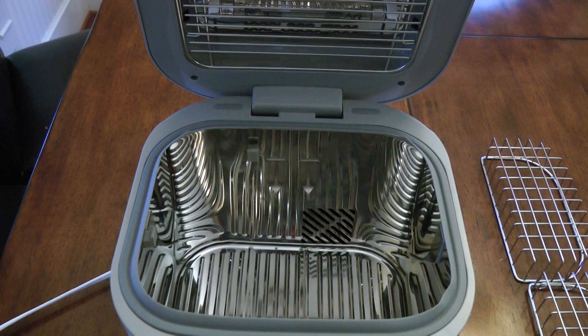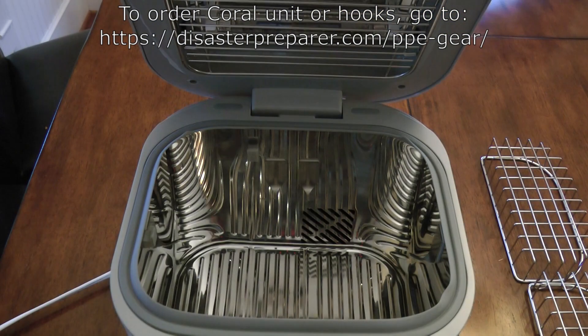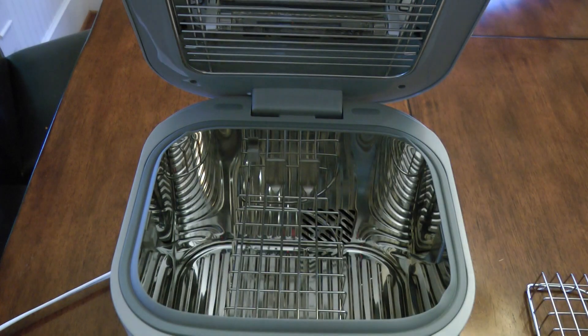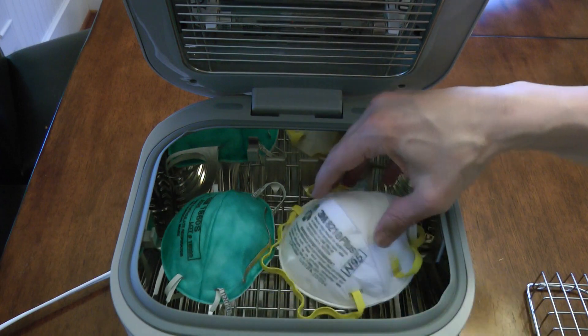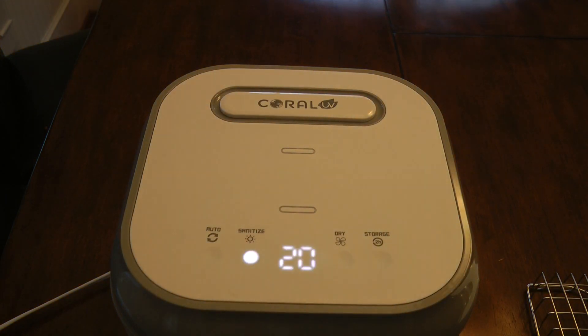This video is going to show how to install the hooks in the UV Coral Sanitizer, which I recommend. I really like this unit for decontaminating N95 respirators. The idea is that you can put a little shelf in here, then take your respirators and rest them on that shelf, close it up, hit sanitize, dial it up to 20 minutes, and let the thing run. For 20 minutes, it shines a very bright UV light on the face of the respirators.